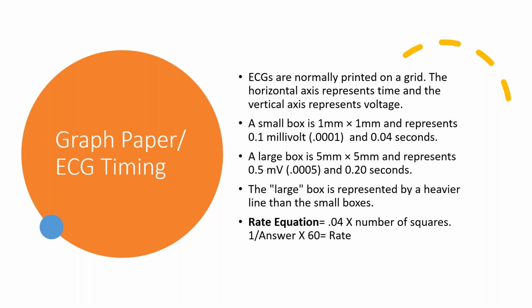I have a rate equation on here, which I like to do every now and then when I go up to patient rooms and just mess around, you know, get my little calculator out on my phone and calculate heart rates, and then look at the monitor and see what it's saying. If I see a printout, just like, I guess because I'm a nerd. Most biomed people are kind of nerds too. But in a group of nerds, I may be more nerdy than even the nerds are.